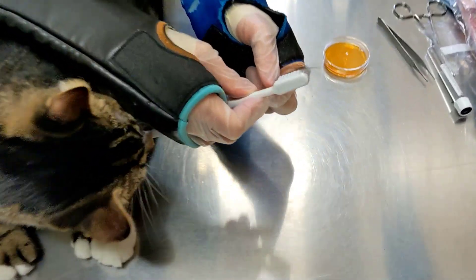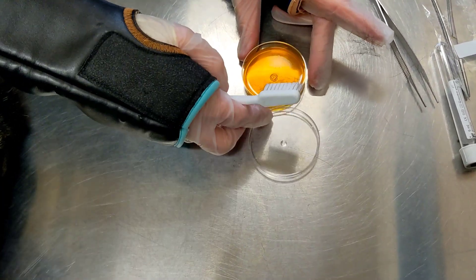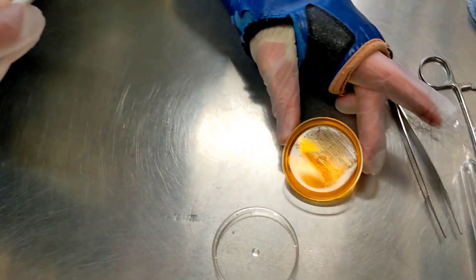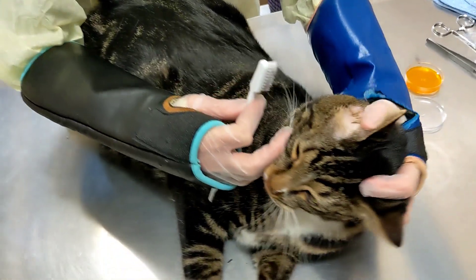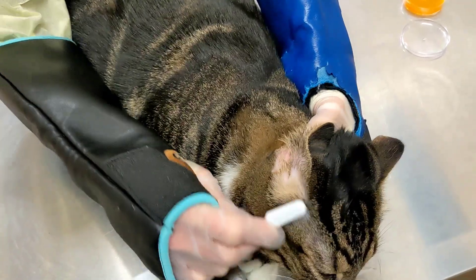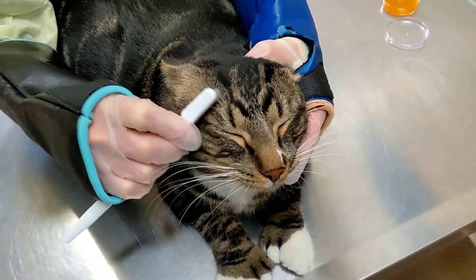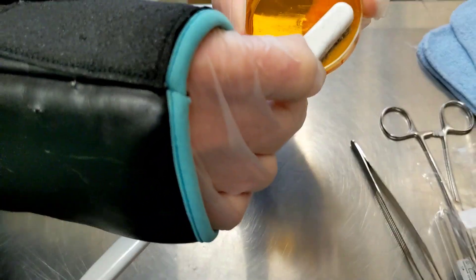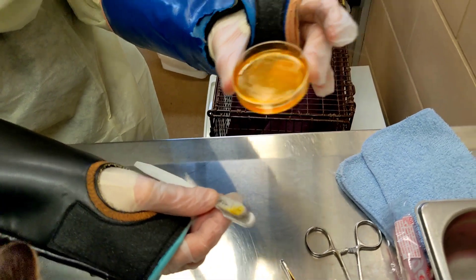You're going to get a whole bunch of hair — I sometimes just remove a little bit of that excess fur. Then you're going to put those 30 swipes down and do one brush across the plate. Then we're going to do 30 swipes of the lesion — we'll pretend he has a lesion up here — so 30 brush strokes of that lesion. If you actually had a lesion you'd be getting kind of gray crusty stuff on your toothbrush. Then go back to your plate, push it down just a little bit, and scrape it across so you should see some grooves. Then throw away your toothbrush.